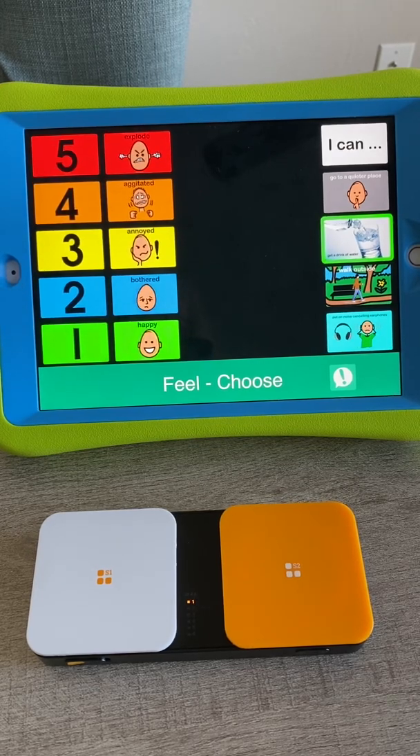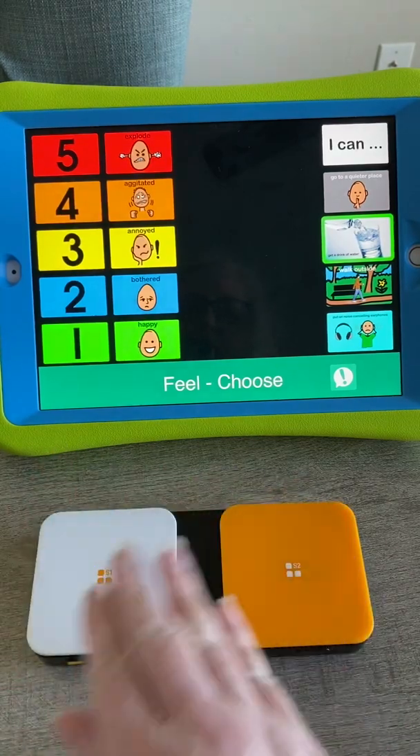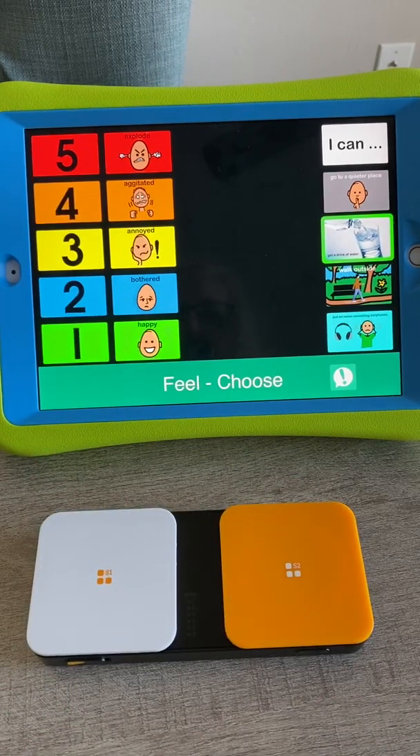Hopefully this will get you started on your basic switch setup. You can also set it to automatically scan and just use one switch as the chooser. But I usually like to use two-switch step scanning.